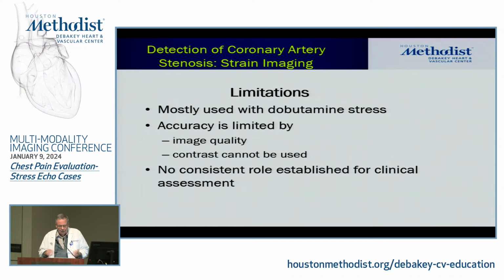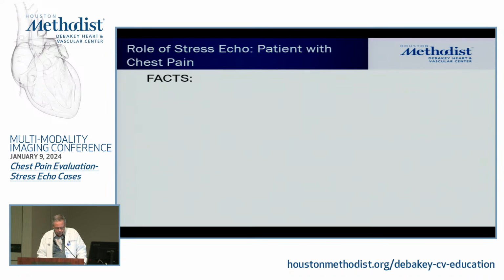Problem is, again, only with dobutamine, and you need to have very good quality images. And as we showed earlier, particularly in good old Houston, Texas, we use contrast a lot. And once you put contrast, it's very hard to do proper strain. So for all those reasons, it really has not reached prime time. It's not something that most people do on a routine basis, including ourselves.